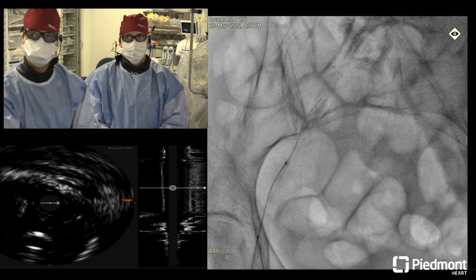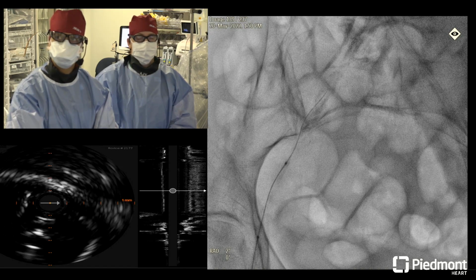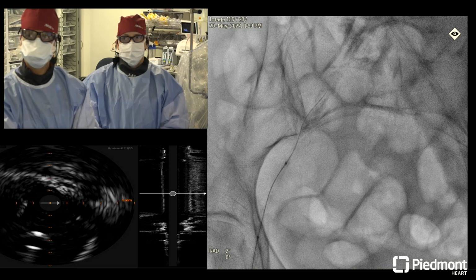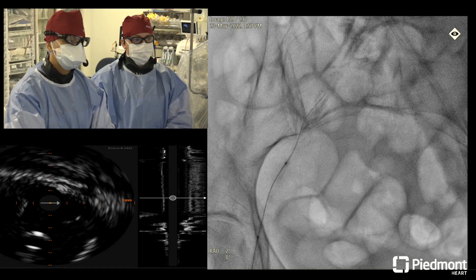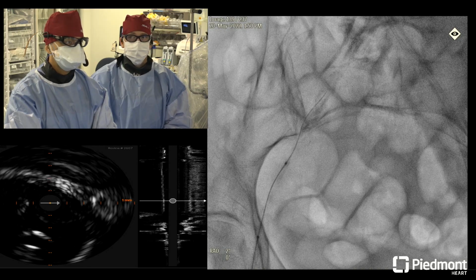Yeah, I mean, it's scary. Drew, you did a great job. I think sticking in that proximal SFA is always the right strategy here, and you can do that safely and close that. And so giving yourself, even if you can just get half your sheath in and then work with that in place, and then again, for the audience, the radial approach works great.